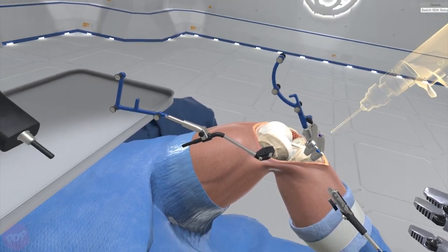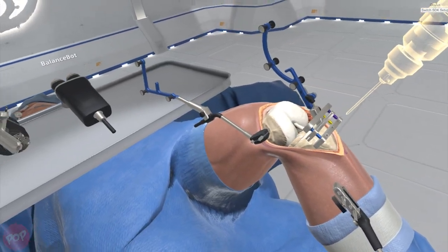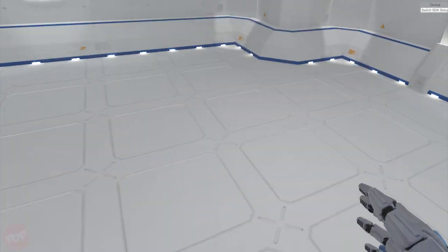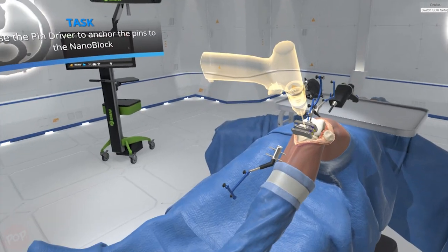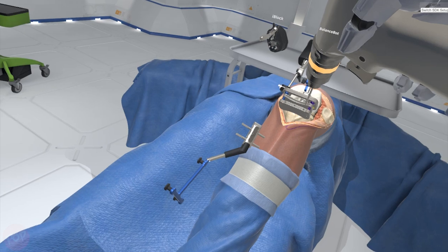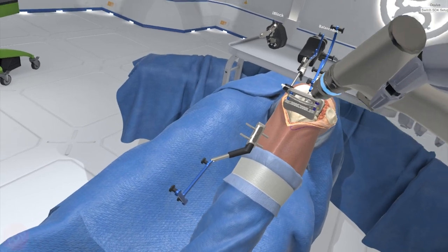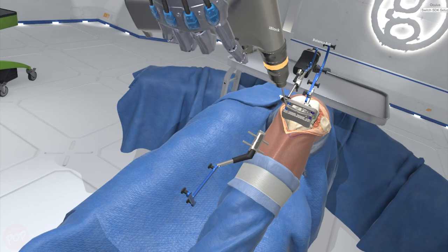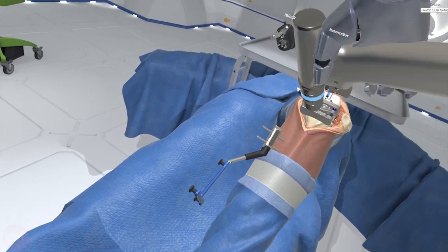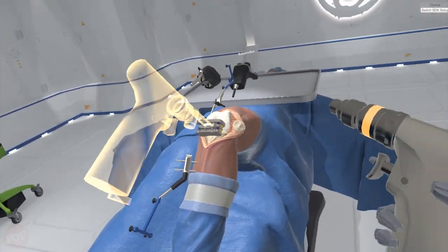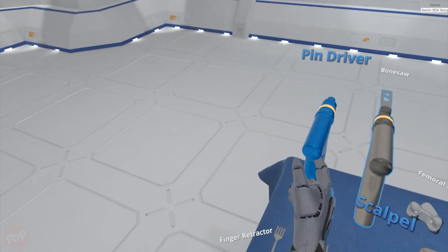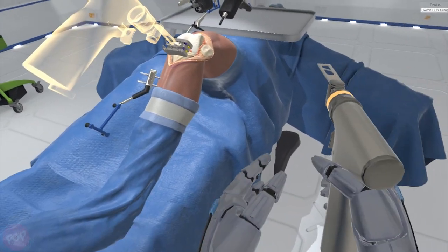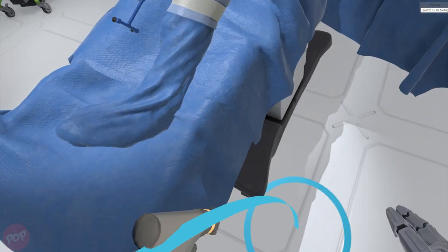Three anchor pins are required to anchor the nanoblock. Grab the pin driver. Grab the bone saw to resect the tibial plateau. Place the blade into the resection guide on the nanoblock to resect the tibial plateau.